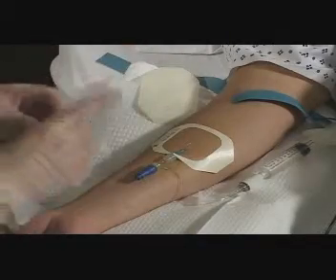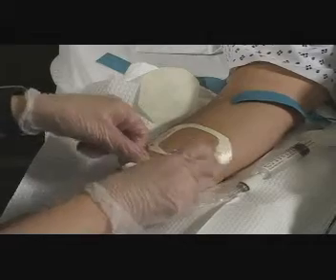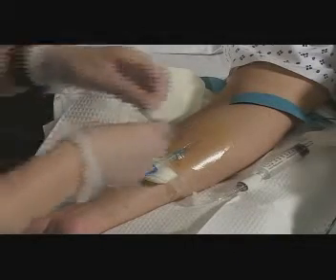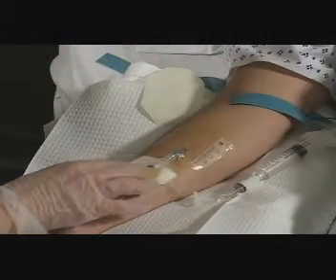Limb and secure the tubing with tape. This allows some slack in order to prevent dislodgement of the IV cannula caused by tension on the IV. Discard the needle into a needle disposal bin. Label the site per facility policy with insertion date, time, needle gauge, and name of nurse.